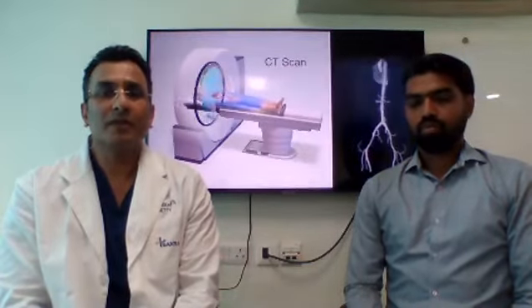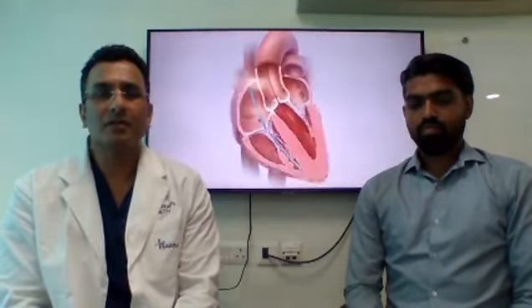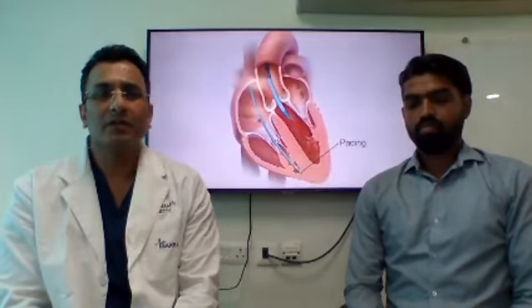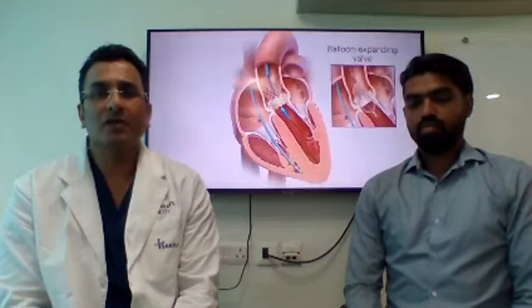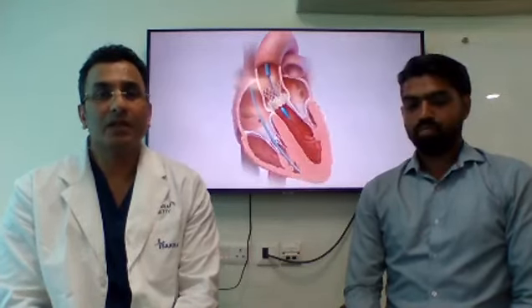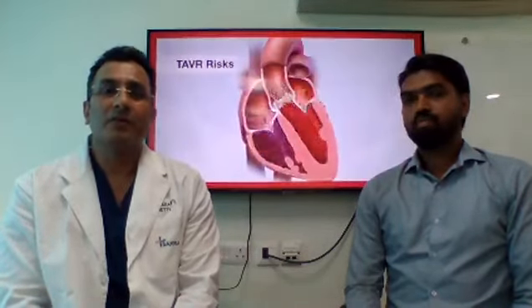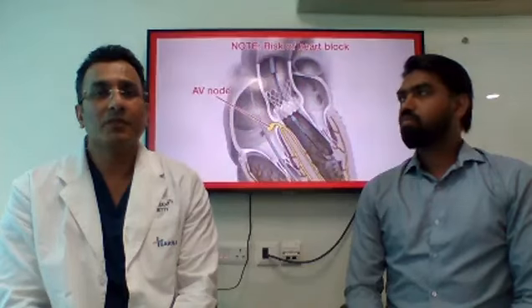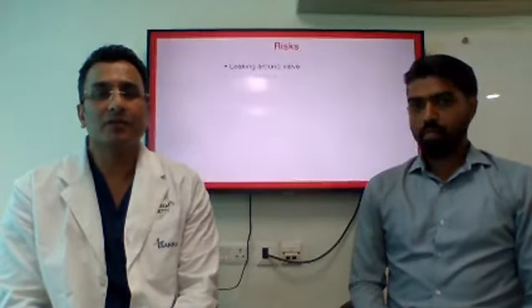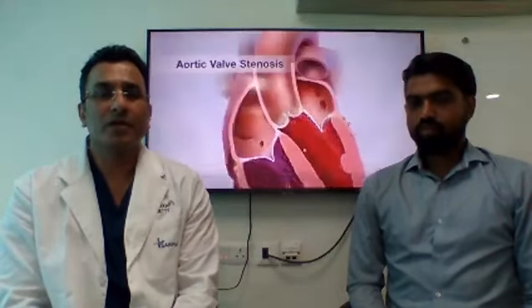TAVI procedure would also be recommended for patients who, other than for age, for other physical reasons such as poor lung condition, advanced liver disease, or previous stroke or frailty. And for these reasons, a patient cannot undergo a surgical aortic valve replacement. Such patients would be considered for TAVI. However, with evolution of the TAVI technology and proven long-term durability, the risk profile of patients undergoing TAVI has shifted from those who are at high risk for surgical AVR to now moderate risk for surgical AVR.